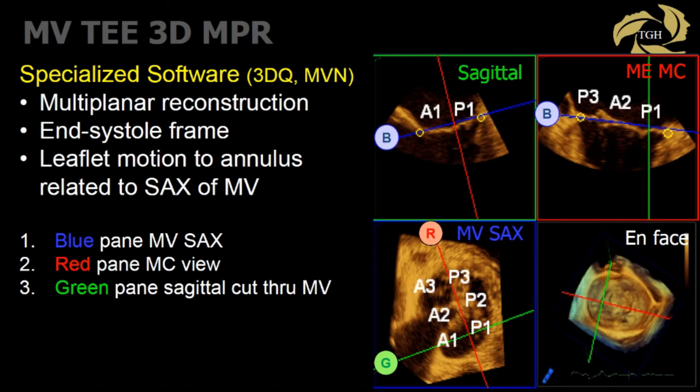What about specialized software? You can use 3DQ or mitral valve software on Philips machines. What you do is deconstruct your 3D volume into multi-planar reformatting or reconstruction. Here, it's an end-systolic frame, and we're trying to scroll through the valve to look for leaflet motion in relationship to the annulus. The blue plane represents a short axis through the valve; the red plane is often the commissural view; and the green plane represents the sagittal cut through the mitral valve. These tools help you understand pathology and the location of pathology.